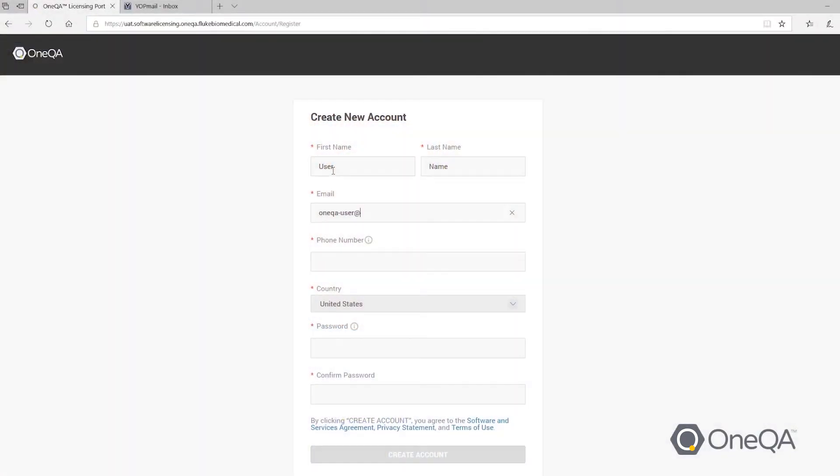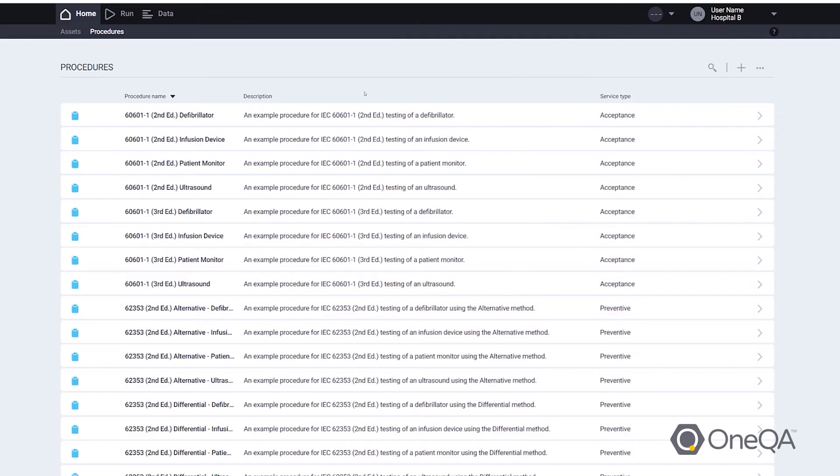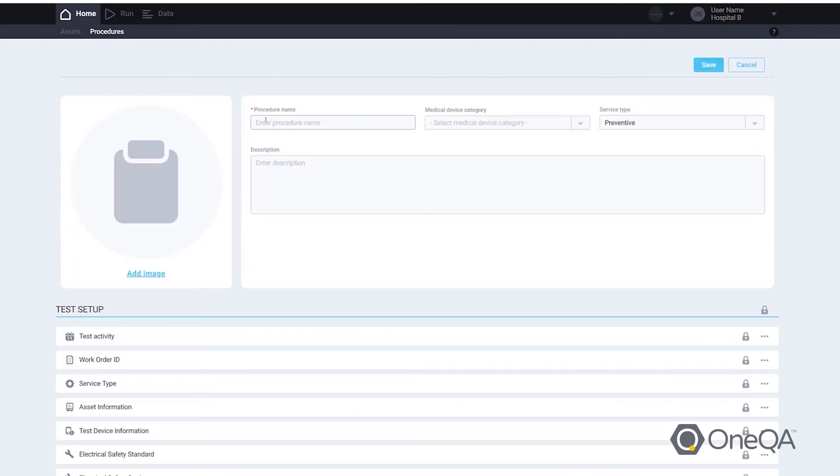With OneQA we offer a trial period where you or anyone in your organization can download the product. You have full use of all the features — running your own procedures, editing existing procedures, modifying report templates. All of that is at your fingertips. You can share your procedures and your work with your colleagues, and your colleagues can also have their own trial as well.